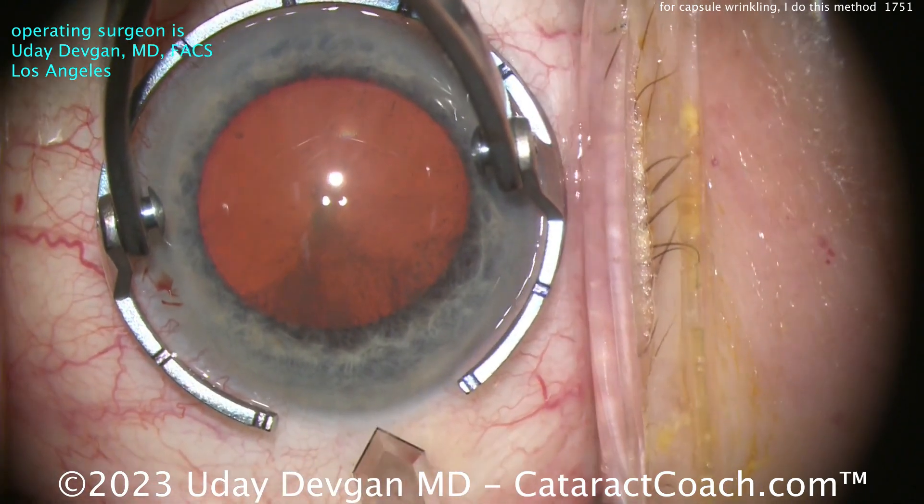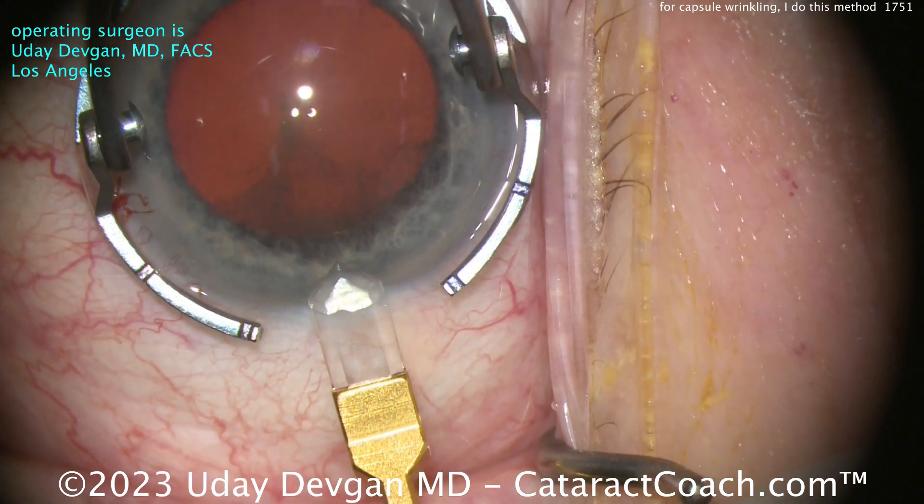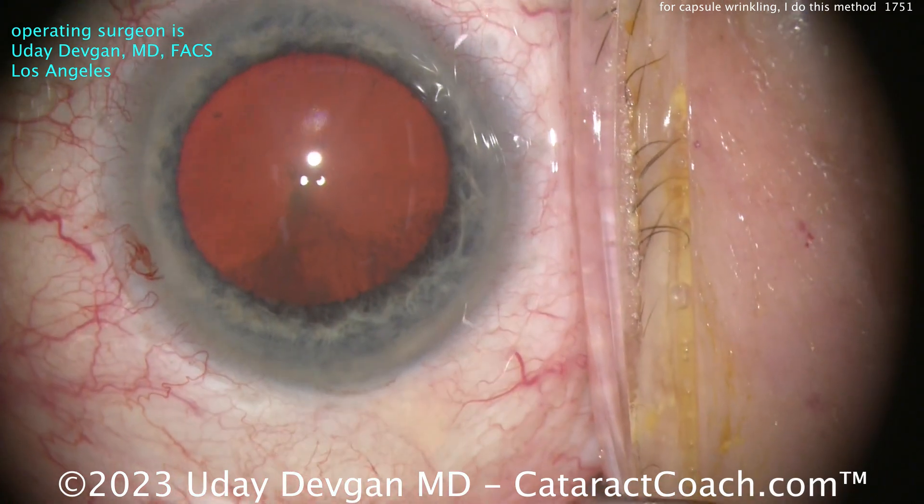Here comes the fixation ring and our diamond keratome. Let's make a 2.2 millimeter incision here. Looks pretty good — just slightly enlarge that a tiny bit.